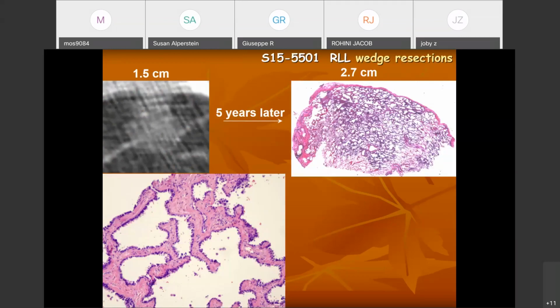If it's the sampling, maybe the surgeon didn't pick the right spot. So, Grace, was it the same institution and same surgeon who followed this up 5 years later? Yeah, same. It's a little lesion, you know. My point is trust cells. If there's discrepancy, maybe there's so many factors. Don't all of a sudden get scared of cells. I get killed by the cells, you know.